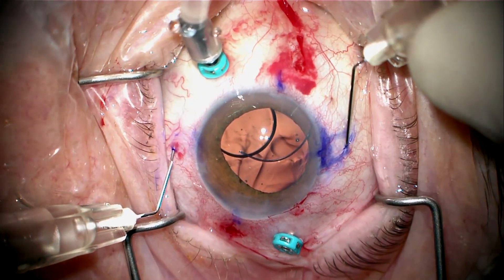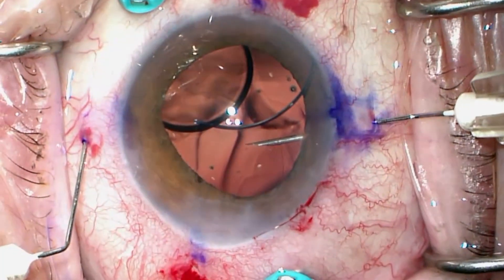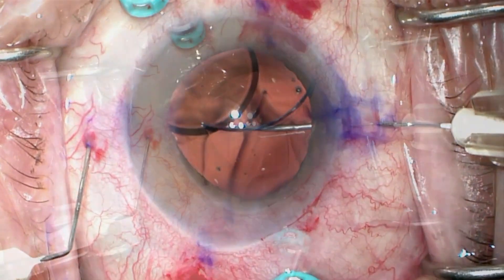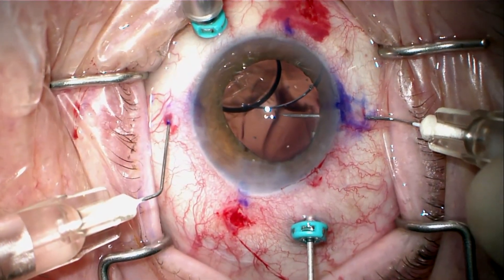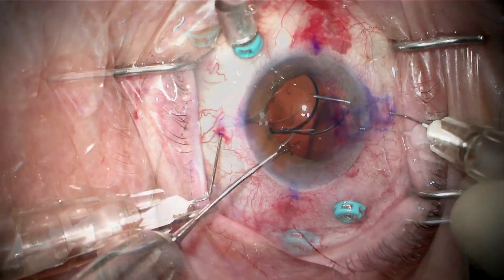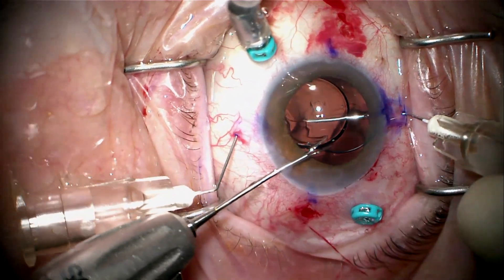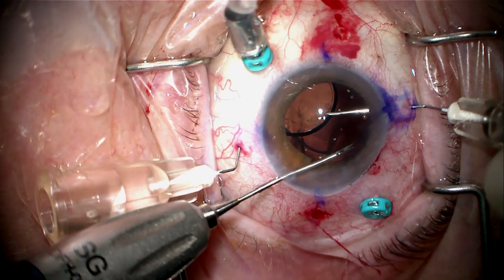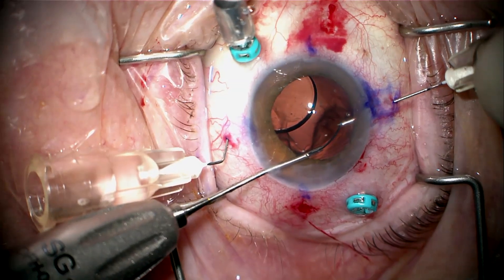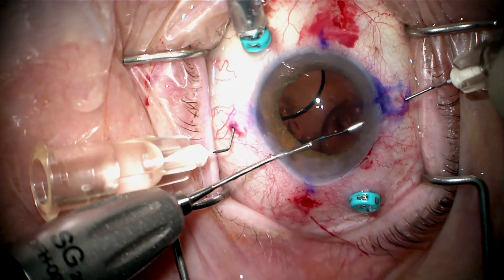This is a long eye and she does have a pretty thin sclera. As I push the needle in, I can see there is some vitreous wrapped around the needle. So I'm going to keep my needle in position and use my left hand to introduce the vitrector so I can cut that vitreous strand. I use the tip of the needle to push the optic and get the haptic in better position so I can grab it closer to the tip and insert it directly into the TSK needle at the proper angle so it slides right in without resistance.